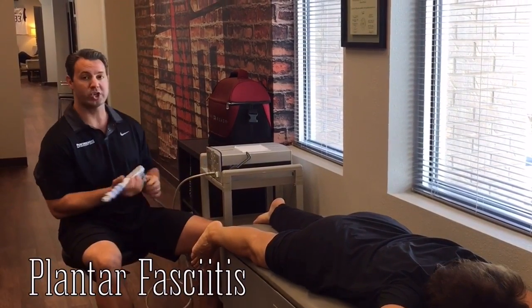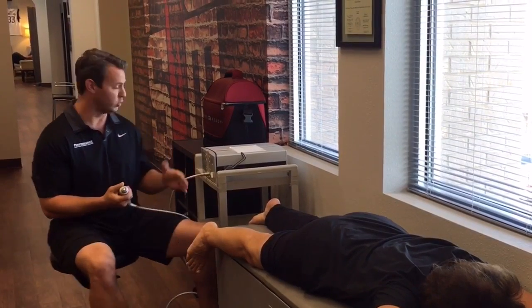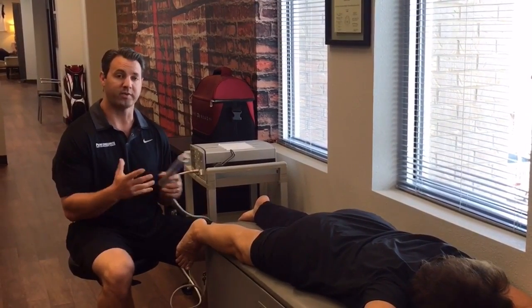Basically, what extracorporeal shockwave therapy does is it uses air pressure through a series of pulses, and usually what we do is about 2,000 to 3,000 pulses per area of injury. What this does is it breaks up scar tissue and breaks up fibrotic adhesions.